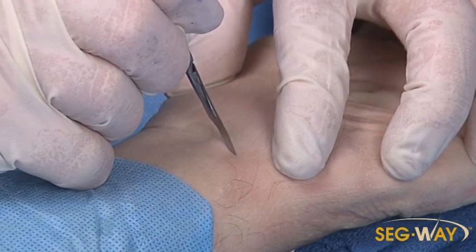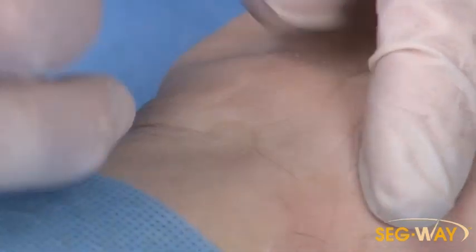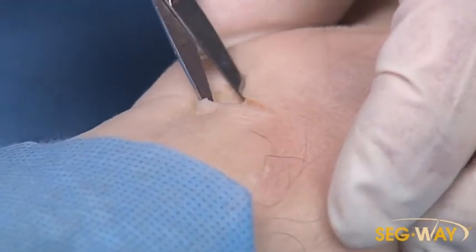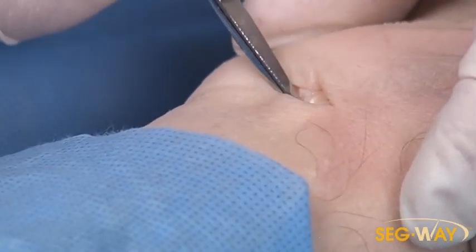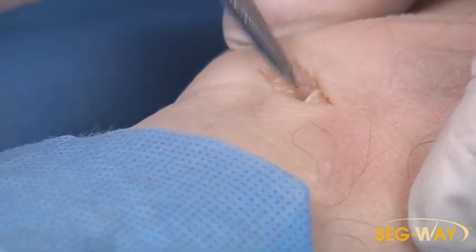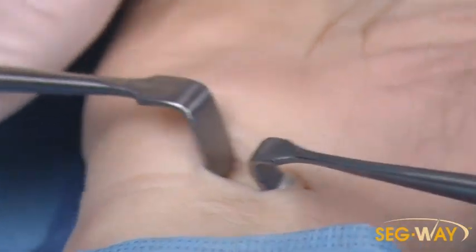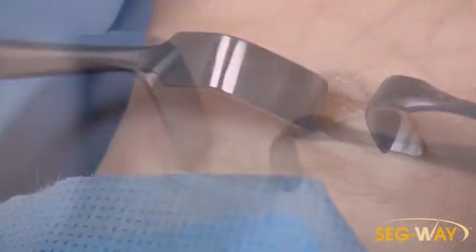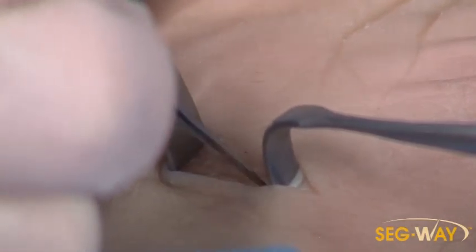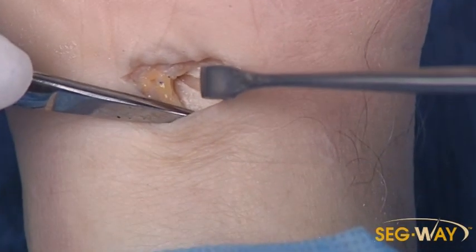I start with a one centimeter skin incision centered between the flexion creases of the wrist, then dissect down. I try to preserve the vessels if possible. Here's the palmaris longus, and with the second retractor you can see the white fibers of the forearm fascia. We're going to incise those in line with the incision, cheating towards the radial side. There's the forearm fascia incision right there.